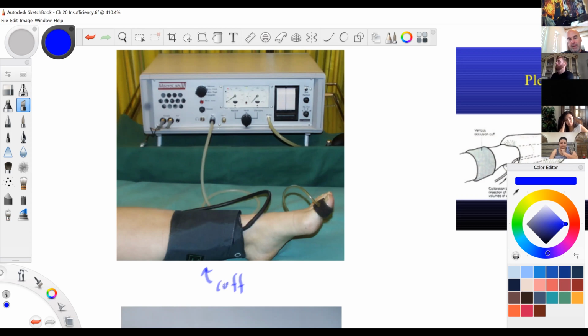What they could do, though, is find blood pressure just the normal way: what's your leg blood pressure rather than your brachial blood pressure, which is your arm? They could find the ankle blood pressure. In order to do a blood pressure, we're filling the cuff so much that we squeeze the tissue so much that we actually close off the artery. You guys know how hard it is to close an artery. So that's what we're doing when we're doing a blood pressure.